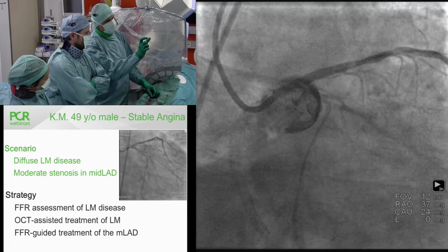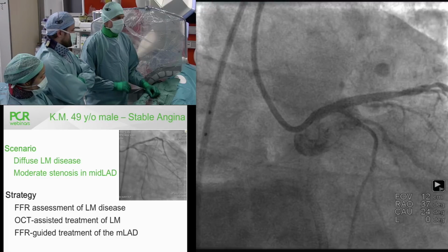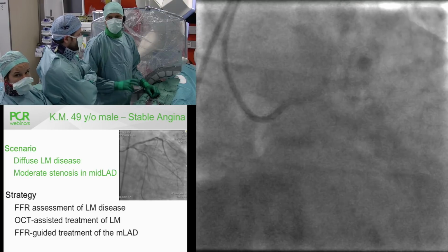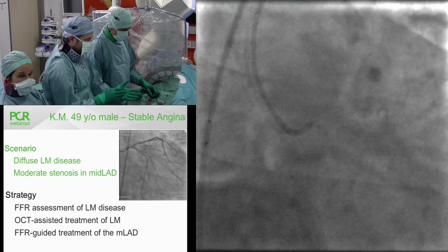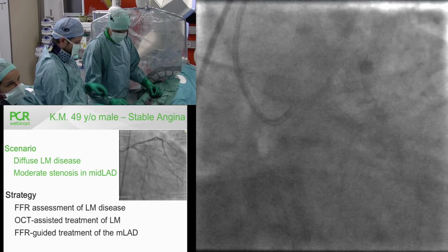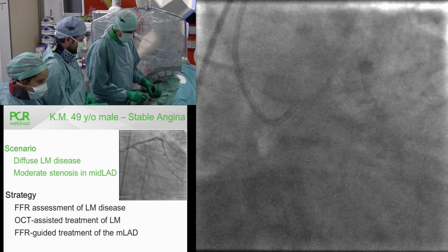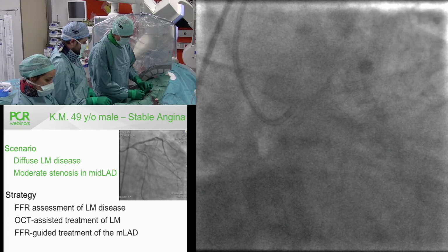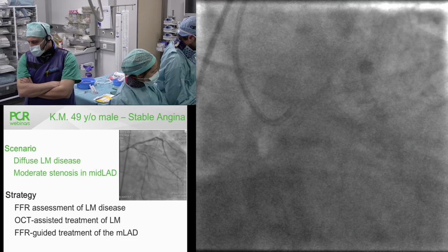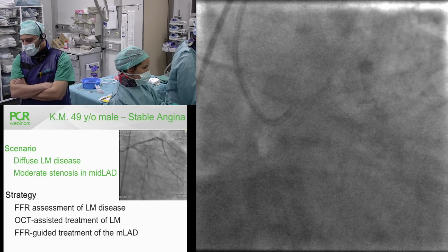It's good, but it's not yet very big. So what I would do, I think personally the part of the stent which is in the LAD is big enough. You agree with that, or do you want post-dilatation? It will be checked by the OCT at the end anyhow. Yeah, but I would like to go even further. Eddie, give a 4.5. You agree with that? Yeah, I think. I mean, it's an 80 kilogram male patient. So this left main will be 4.5, even 5. But we will check on the OCT at the end.